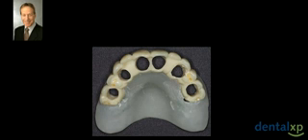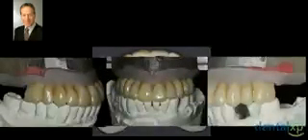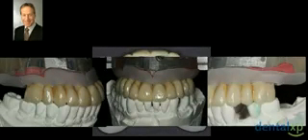Prosthesis was fabricated by using a special mucosal support holder, which means that the dentist was able to try in the provisional restoration prior to the surgery to confirm lip support, intermaxillary relationship, and ultimately this holder is removed at the time of surgery after the appliance is joined to the implants.